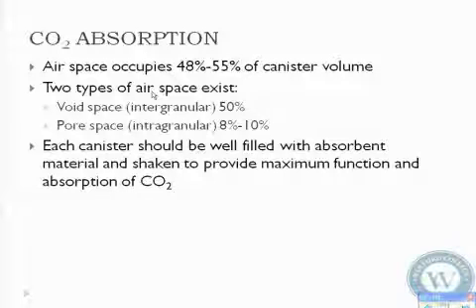No more than 1 week. Okay, so I'm glad you brought that up. How long do they last? No more than 1 week, period. If you put it in a brand new machine and you haven't used the machine at all, the week comes and goes, and no patient ever saw that machine. The next Monday morning, you should change it, okay? Because it still loses the moisture. It still can dry out, okay?